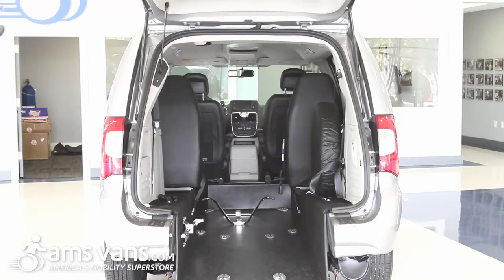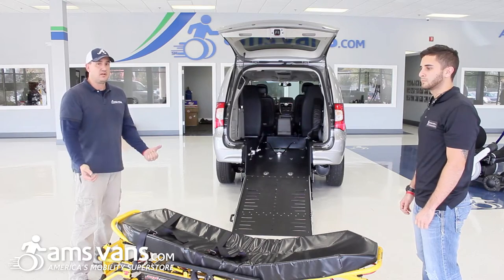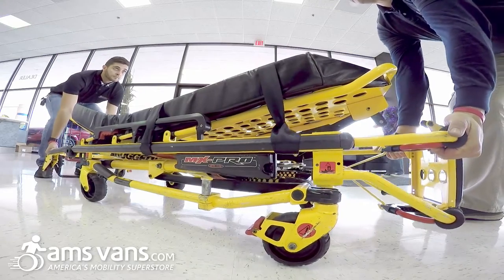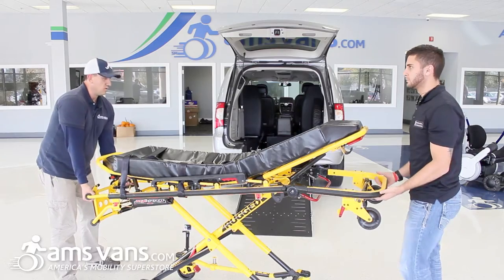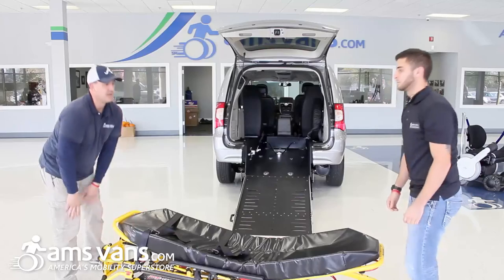On the Gurney, it does require two people to actually operate it — to lift it up and to lower it. We're going to demonstrate how that works. There's a little lever over here; lift it up at the same time and go to the spring. And then when you're ready to lower the Gurney, we're going to lift at the same time and bring it down. And that's how you do that.